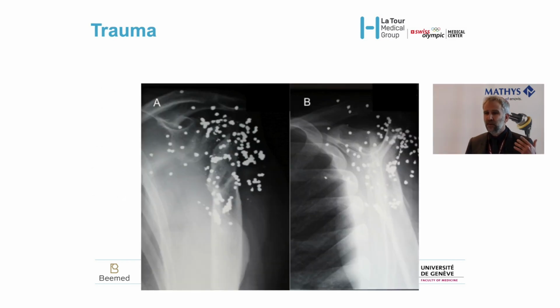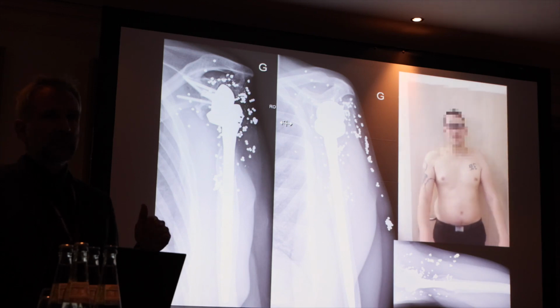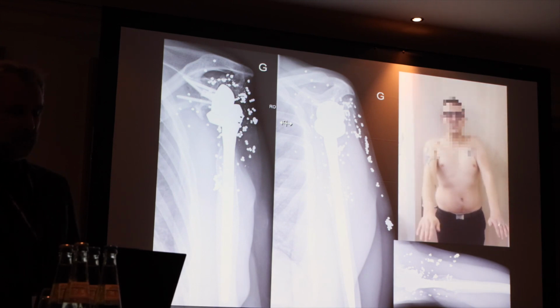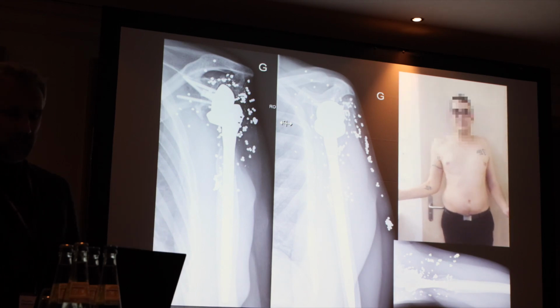In 2005, when I was on call, God talked to this guy and said, you should kill yourself. So he tried to kill himself, and I spent the night removing bullets from his shoulder, doing some kind of coagulation. And 2 years later, I implanted in this patient, with Gilles Walch, a reverse shoulder arthroplasty in Lyon. And this is the 10 years result. It's not unbelievable, but this patient has now a family, he is happy, he's a pizzaiolo in Geneva, and even if it's not perfect, the reverse allowed us to give him a new life, you know.